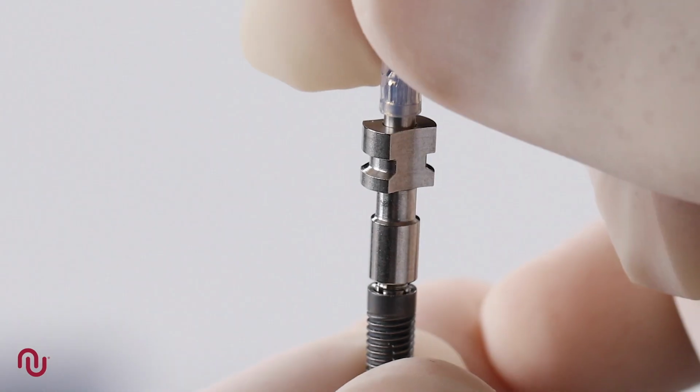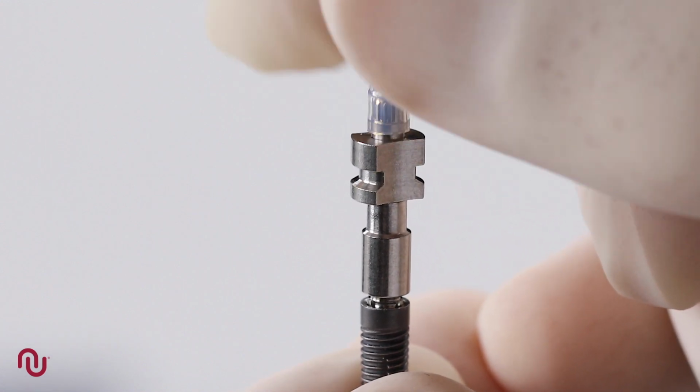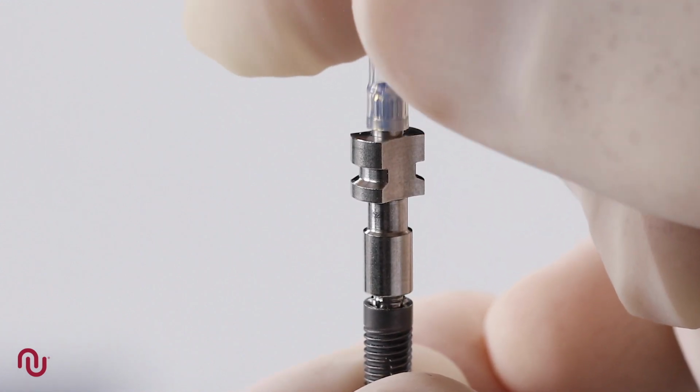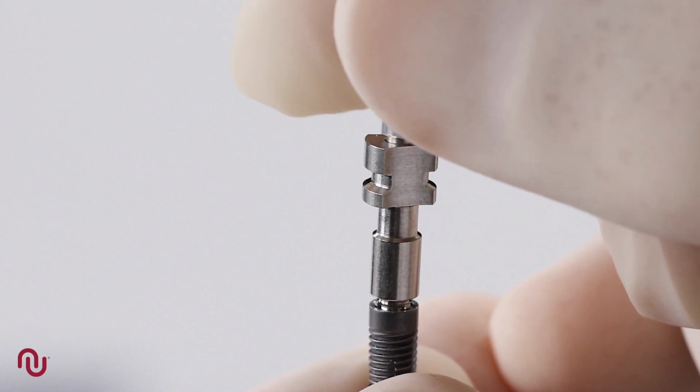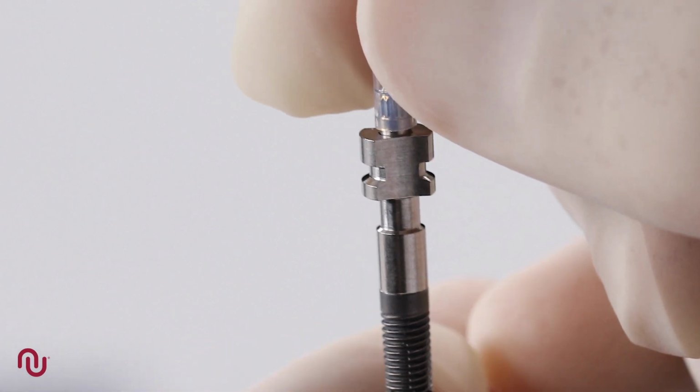A unique feature of all Neoss impression copings is that they are self-seating. This means that the screw will not engage the implant if the coping is not correctly seated. However, a radiograph is recommended if there is any uncertainty or risk of soft tissue entrapment.